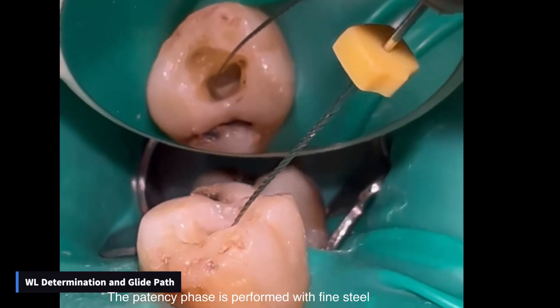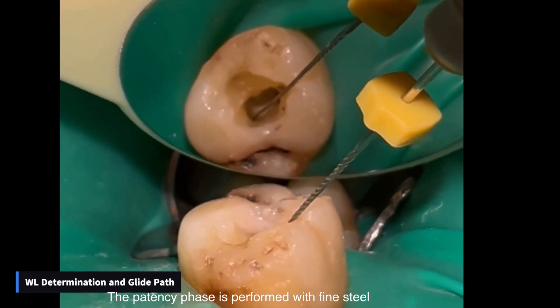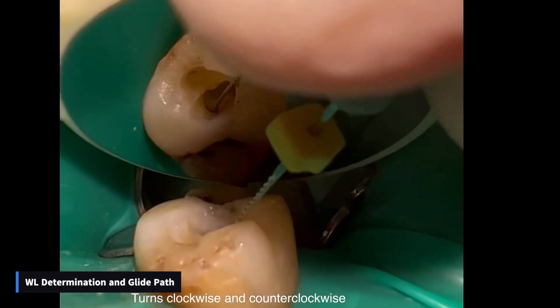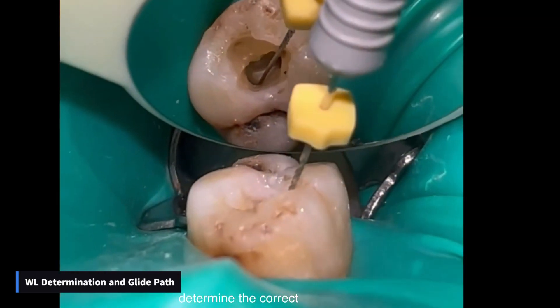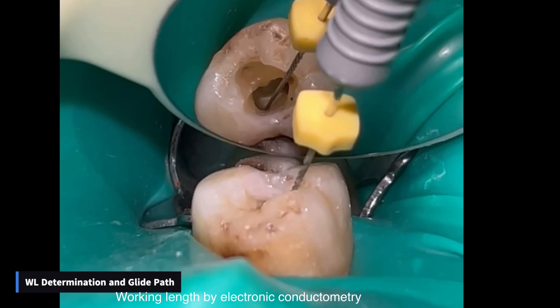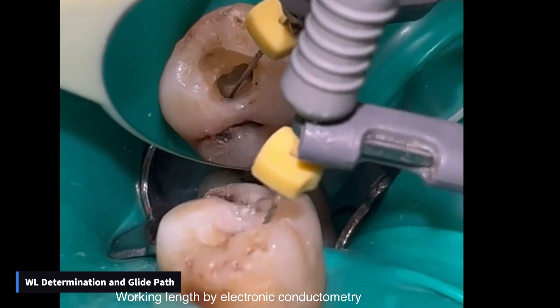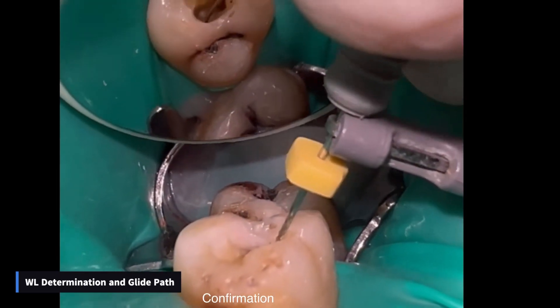The patency phase is performed with fine steel files with gentle quarter turns clockwise and counterclockwise to determine the correct working length by electronic conductometry and radiographic confirmation.